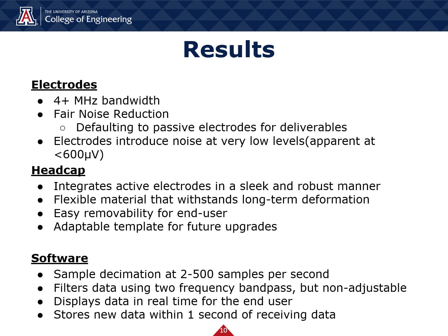Our electrodes had the bandwidth needed, however, they failed to improve SNR and introduced broadband noise at the low input amplitudes. Our solution was to bypass the active electrode circuitry and feed the signal directly through. The head cap, as designed and fabricated, helps give adequate contact for the electrodes to the head while simultaneously providing access to the skull for ultrasonic probes.